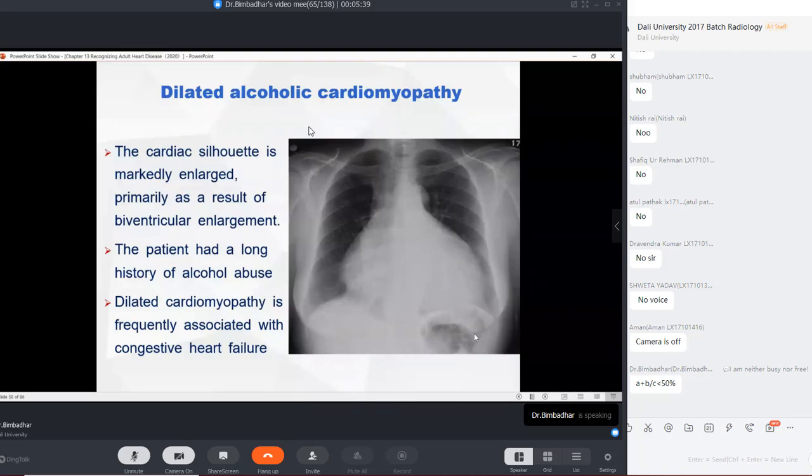When you measure in the image, generally in these exams you will be given the values, and they say that A plus B, or small T, is the cardiac diameter, and capital T is the thoracic diameter.